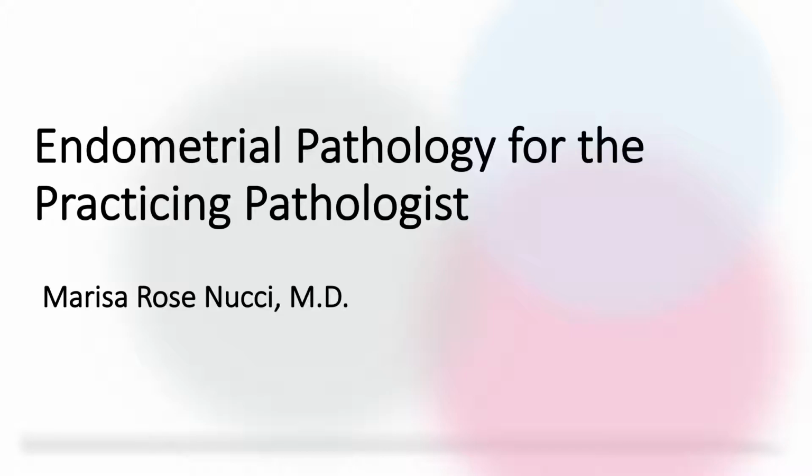So this first session, we're going to talk about a practical approach to endometrial pathology.